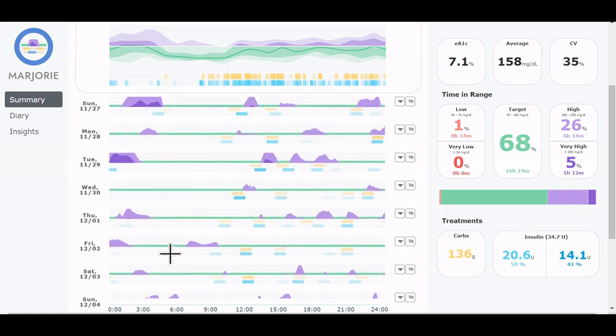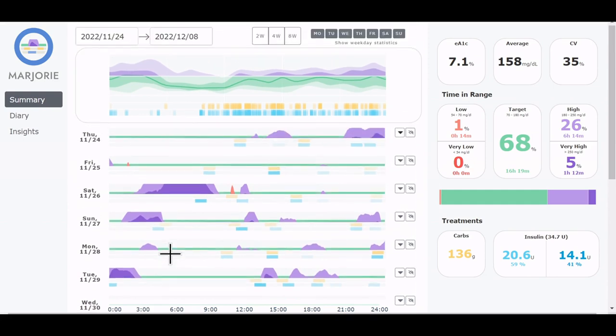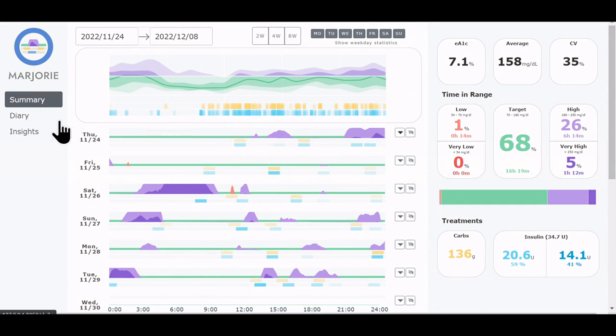A particularly high glucose period occurred here on 26th of November, and we don't immediately see any reason for that here. And to look up the details of this day, we go to the diary view.